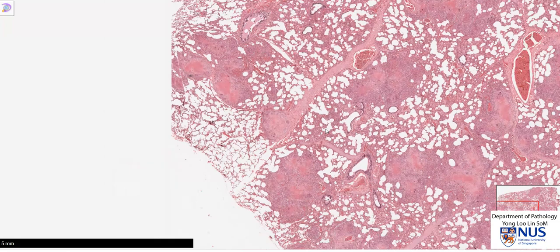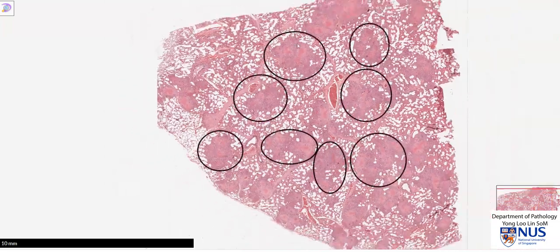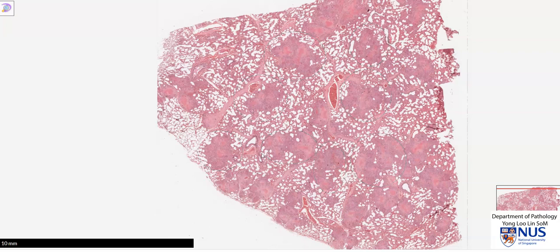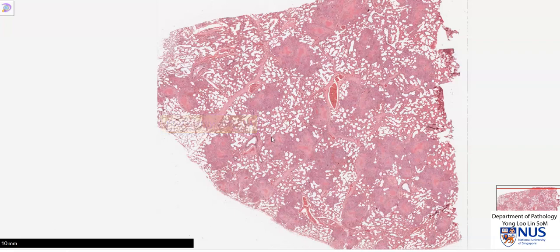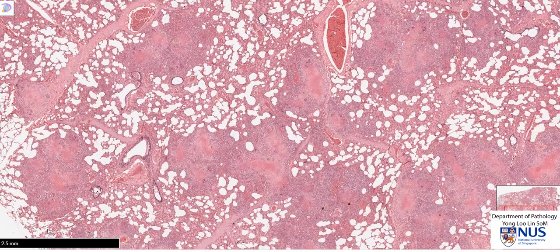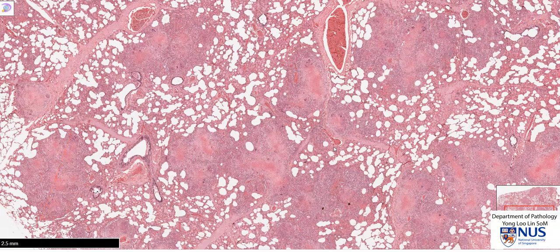Very obviously, we can see that there are many areas that appear more solid, dotted throughout the lung parenchyma. This is a classical low magnification appearance of miliary TB. When we say miliary, we are referring to the millet seed, which is very small — less than 2 millimeters in maximum dimension. Looking at the scale here of 10 millimeters, most of these little areas of inflammation are actually less than 2 millimeters in maximal dimension, hence miliary.